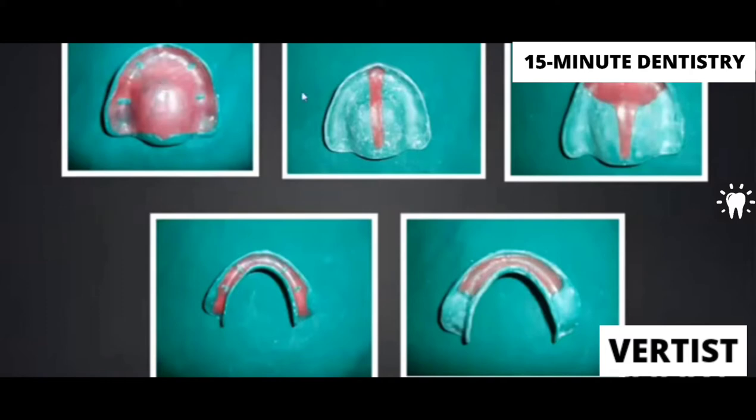So suppose in this second picture, there is a spacer only in the I or in the incisive papilla and the mid-palatal raphe region, and there is no spacer anywhere else. That means there is more space in this region for the impression material. Therefore, there will be much less pressure in this region than there would be in the rest of the region. So you just have to know what is the philosophy. Similarly, for the mandibular, the buccal shelf area is cut back. Buccal shelf area is the primary stress bearing area. Sometimes there is this design also. So you follow the design of your institution.